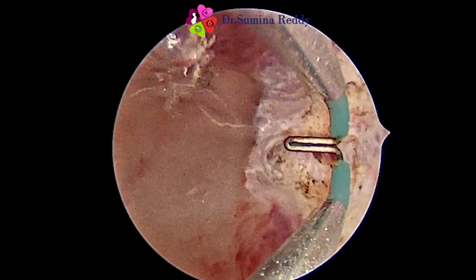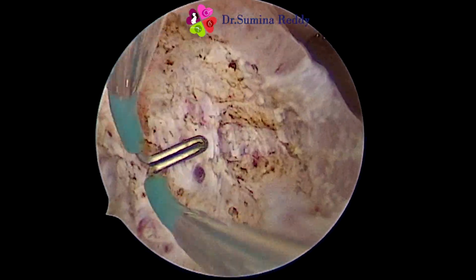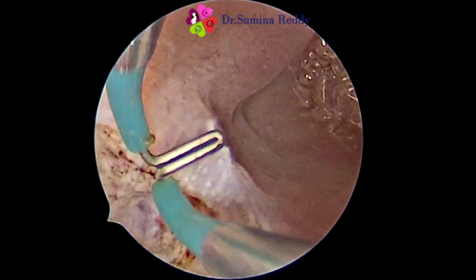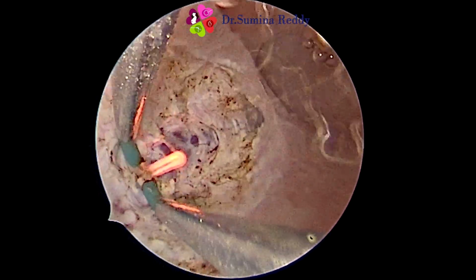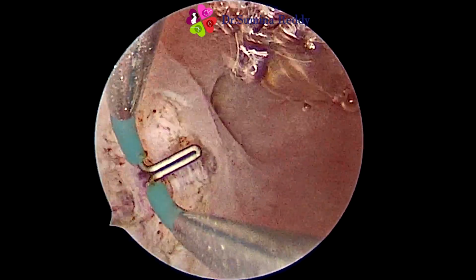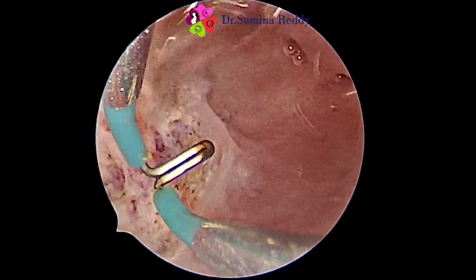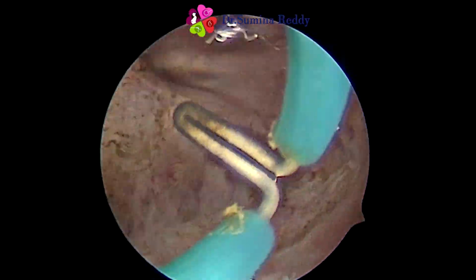Initially, the anatomy is located, and the location of the external os, internal os, and both the tubal ostia are identified. Resection starts at the apex of the septum in the midline in the avascular plane, and using the bipolar resectoscope, resection proceeds stepwise in an upward direction under direct visualization.